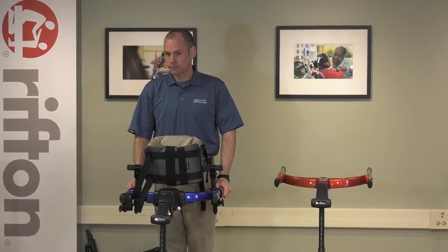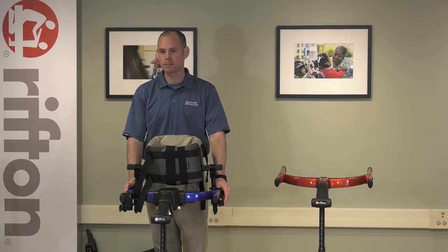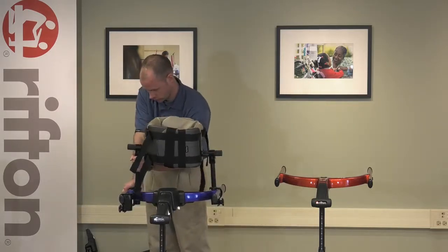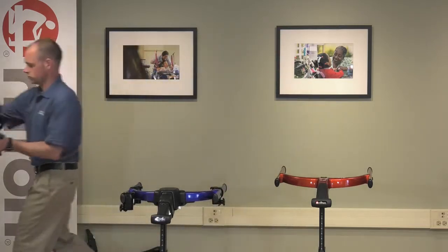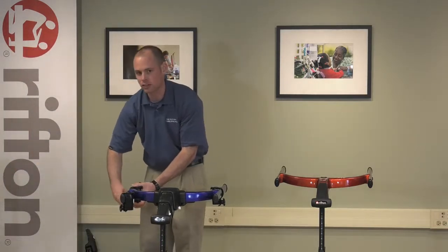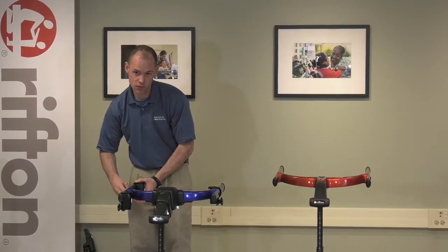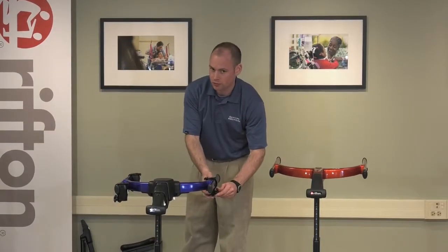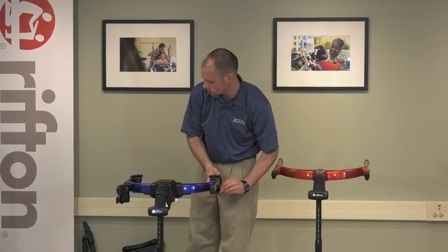There's a request to see the hip positioner. Okay, I'll demonstrate how you'd put the hip positioner onto the pacer. Of course, the multi-position saddle covers a lot of what a hip positioner is for, with pelvic positioning, but you have to do what's right for your client, and so the hip positioner is still available if you need it.